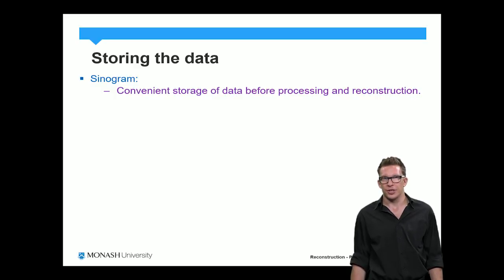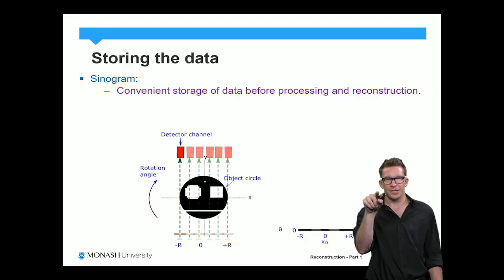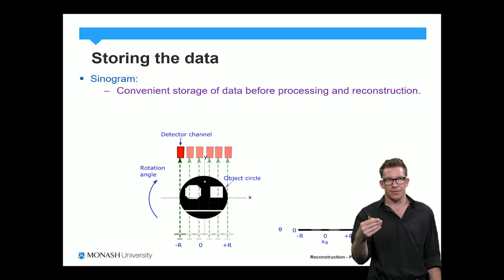Now I'm going to introduce you to a new term which is called sinogram. So the sinogram is a convenient way in which the data is stored when it's acquired during a CT scan. So in order to give you a representation here, I've just developed a cartoon. So here we can see the translate rotate geometry that we've discussed previously, and we can see that we have a phantom which comprises a circle, a square, a small point, and a bar or a line. Now, if we consider for each of the red detector channel locations at this given projection angle, which is 0 degrees, if we consider the intensities which have then been converted into attenuation values, we would have a number in each one of those red detector channels. And if we plot those numbers as colours, where black is a low number and white is a high number, we would get the distribution on the right hand side of the slide here at 0 degrees.